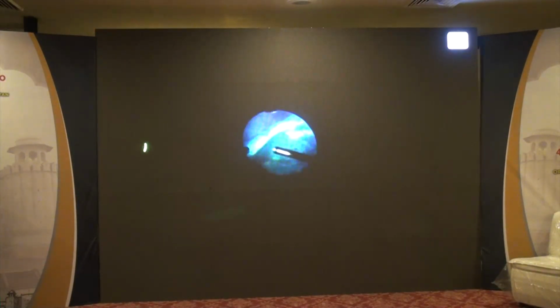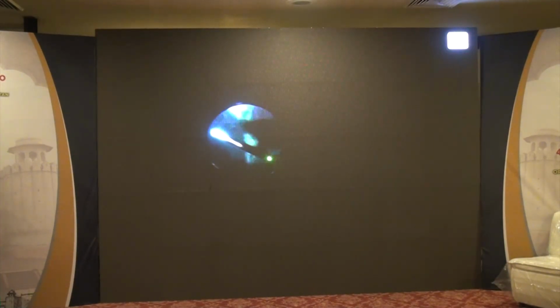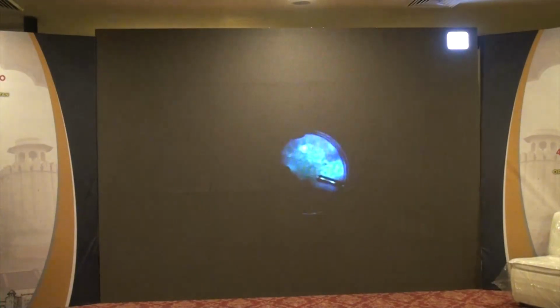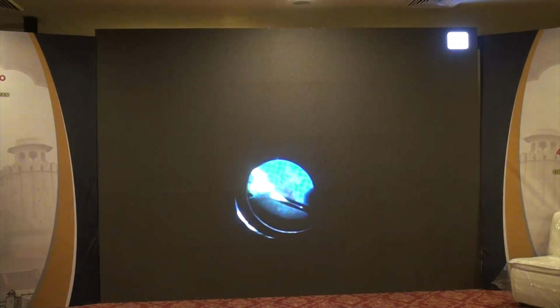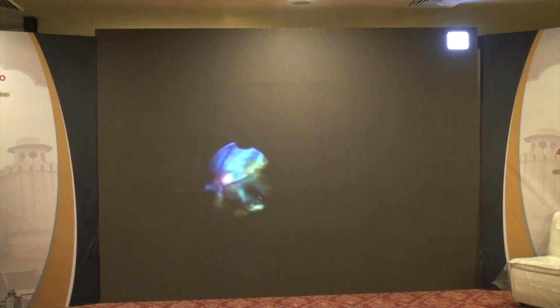So here she is. This is the macular area, and this ring is encroaching, passing through the macula onto the disc. I'm at the moment examining the extent of the problems. This was subretinal exudates.